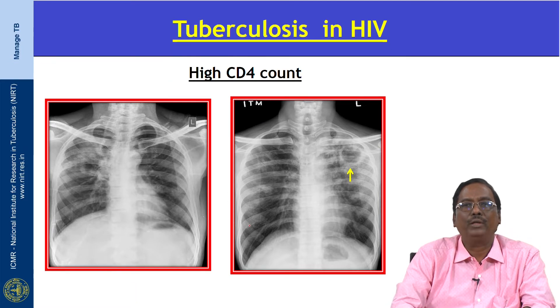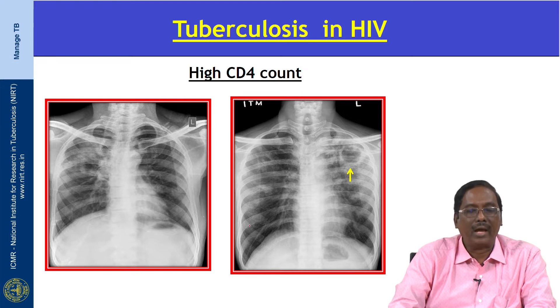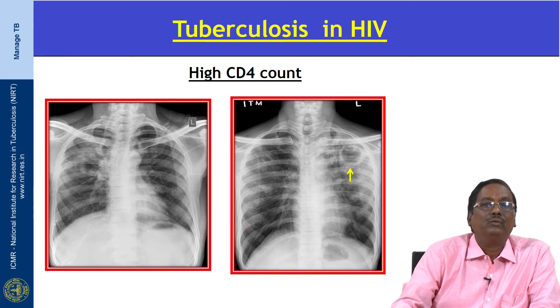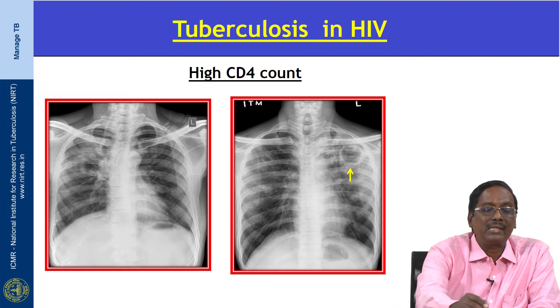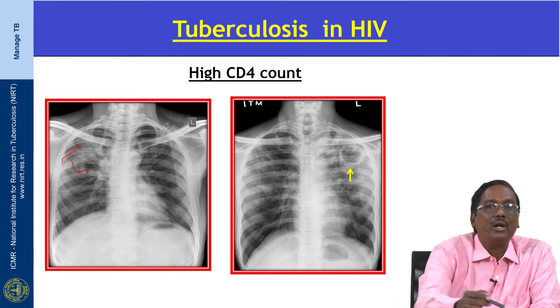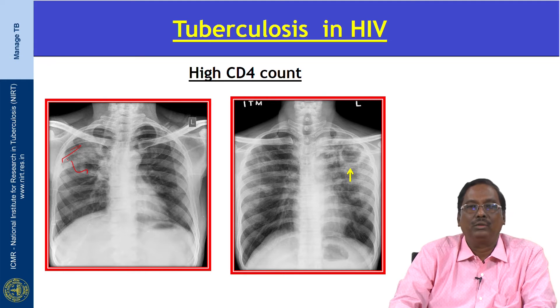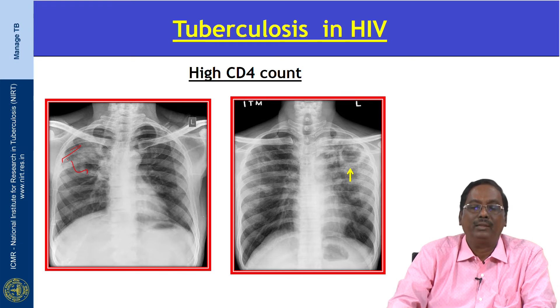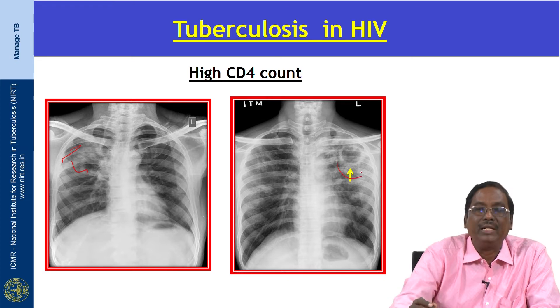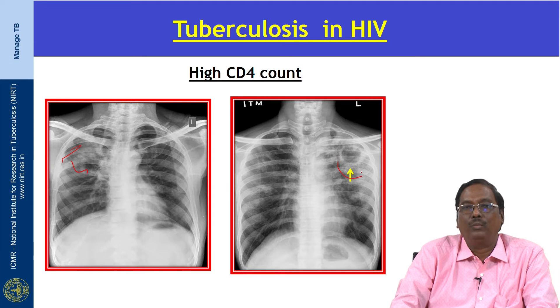This x-ray shows tuberculosis in HIV where the CD4 count is very high. There is a classical consolidation — an airspace opacity involving the upper zone, specifically the apical and posterior segment, typical of post-primary TB. There is also a cavity in the upper lobe.